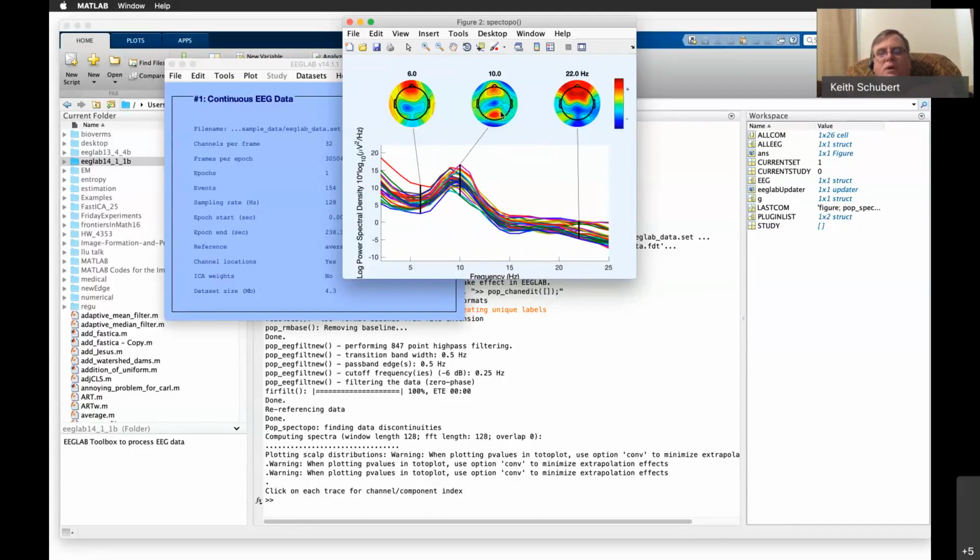You see a spike in the back and a spike in the front of the head. The back of the head is where you do your optical processing, and the front is going to cover your basic eye motion. You're going to get a little thing as the person's eye focuses. So this is probably the eye actually focusing, more EMG or EOG type stuff. And on the back here, this is actually processing the image in the occipital area.